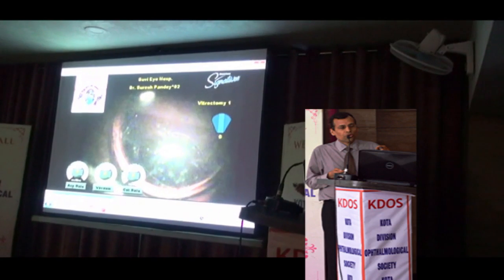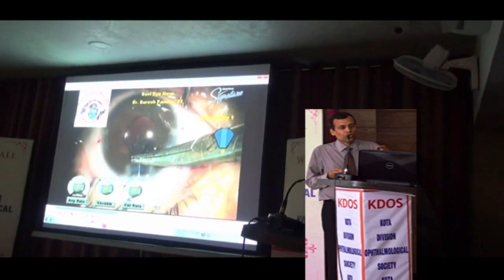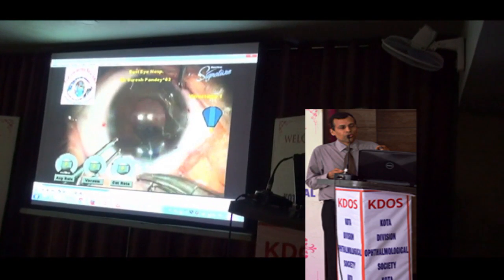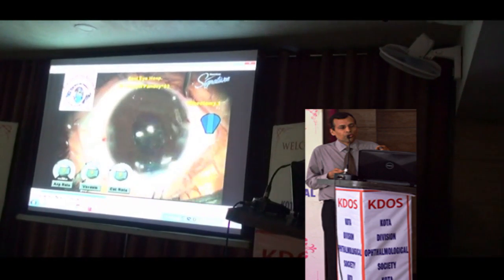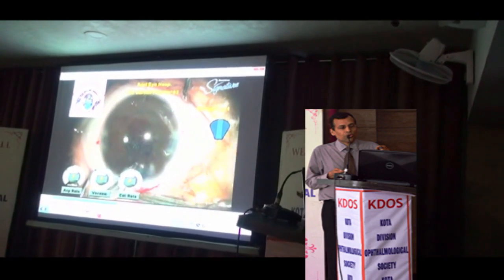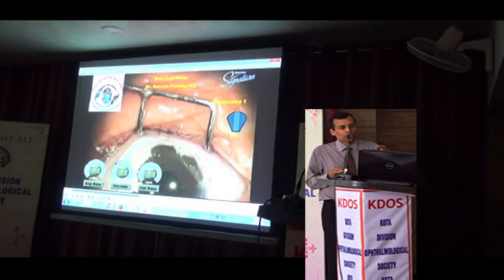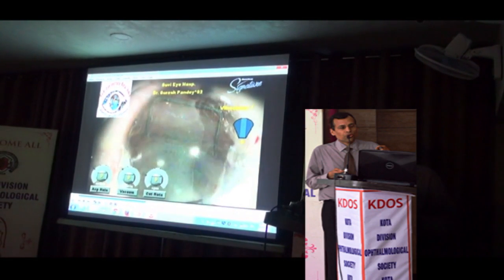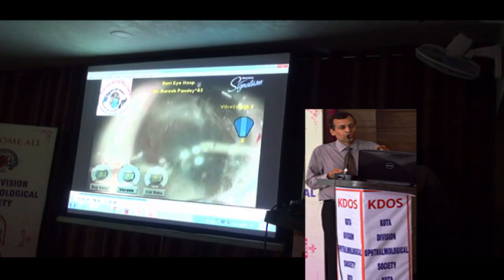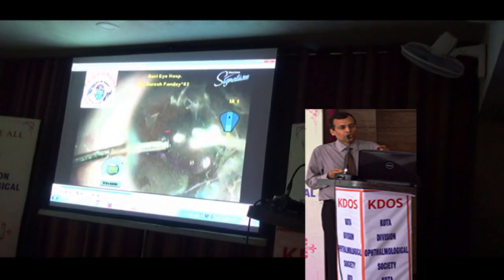Using the vitreous cutter, I perform the primary posterior capsulotomy and anterior vitrectomy. And it's very important to suture the main incision and side port incision because of the low scleral rigidity causing this collapse effect in these cases. So always suture the main incision as well as the side port incision, because children tend to rub their eyes. I also use a preservative-free intracameral triamcinolone injection to stain the vitreous.